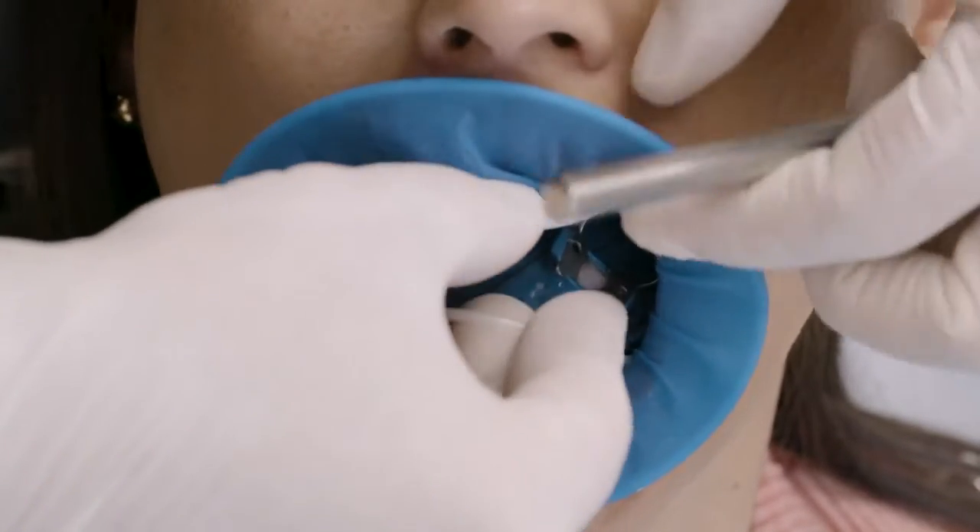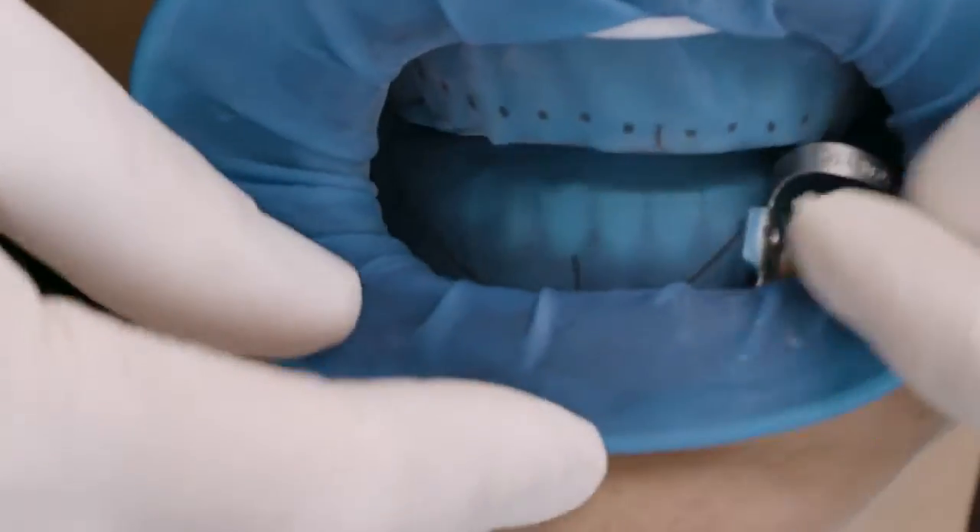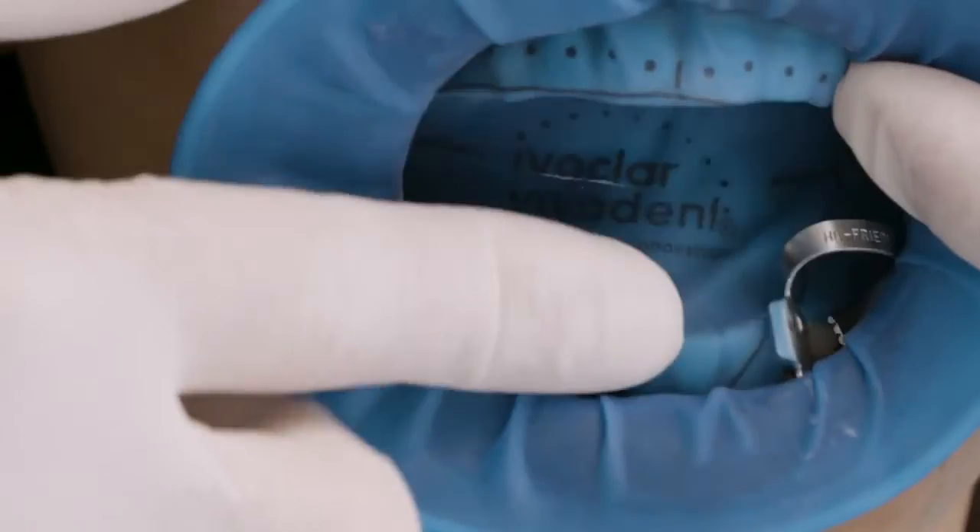Subsequently, position the dam behind the lower and upper lips. Place Optradam first in one corner of the mouth and then in the opposite one. Having the patient close his or her mouth aids placement of the dam.